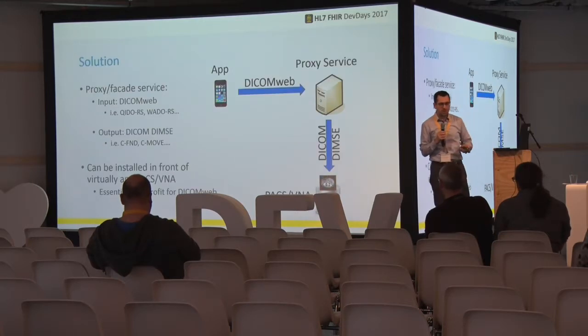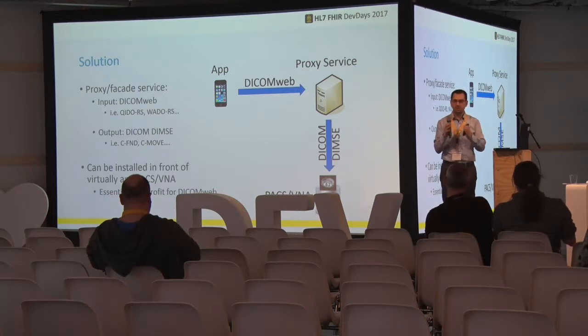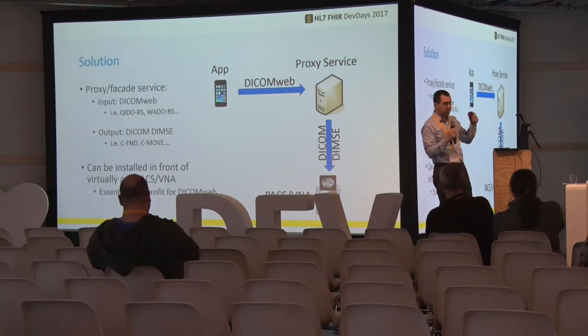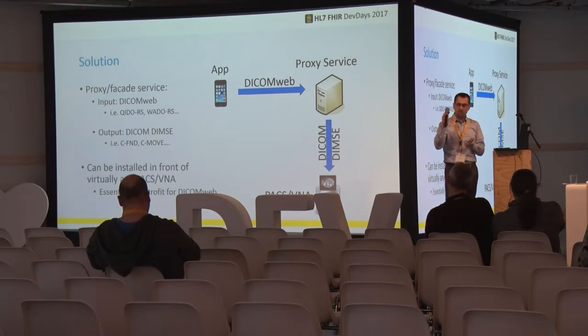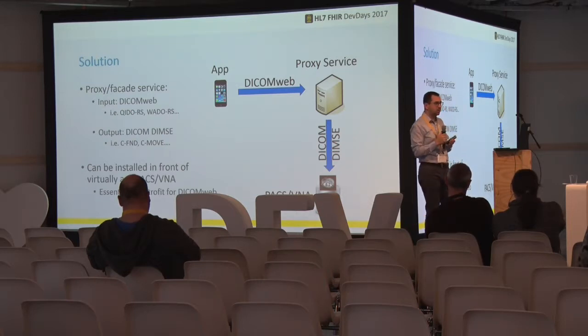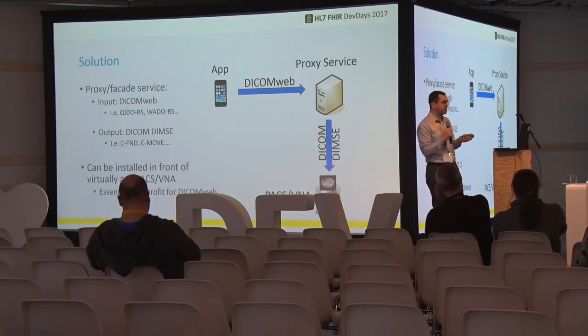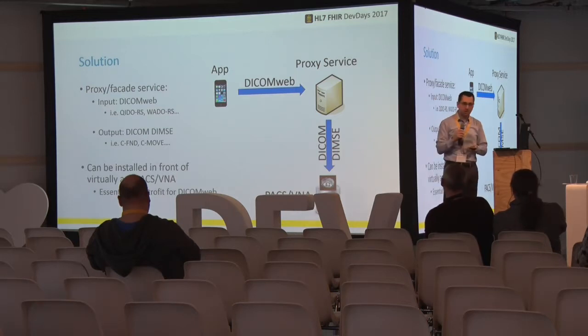So what can we actually do to make this work? Here's the use case that we're trying to solve. Imagine if we could put a proxy or some kind of facade in front of your traditional PACS or VNA to make it speak DICOM Web. So it's almost like a translation service. You have an app, which is the iPhone there. It can speak DICOM Web to this proxy service that you put in the middle, and then that proxy service translates that into traditional DICOM DIMSE, and then everything just works. It would be really nice. And of course, you can install this in front of your PACS and run your organization, and voila, you can essentially retrofit your old PACS or VNA to the modern age, basically.